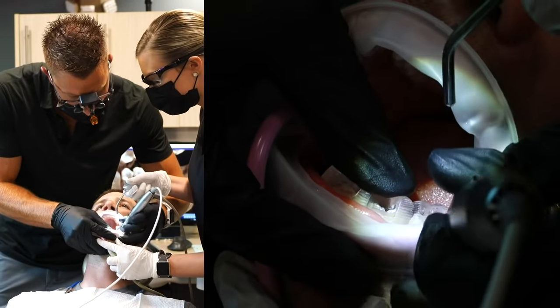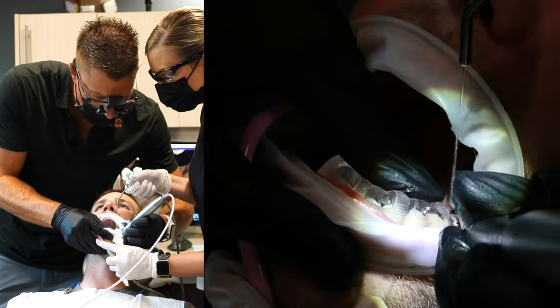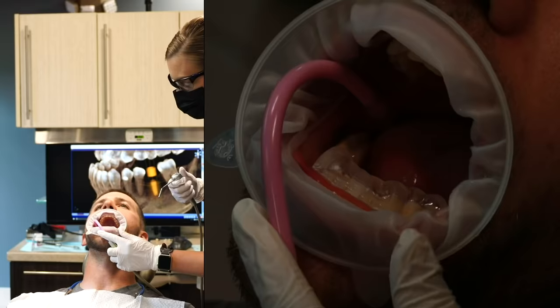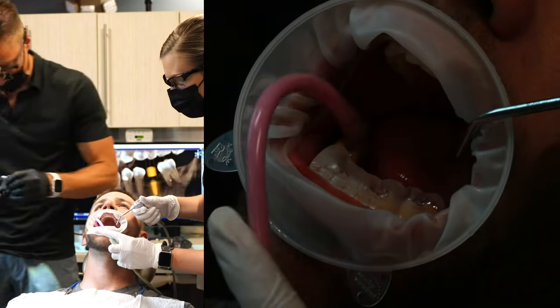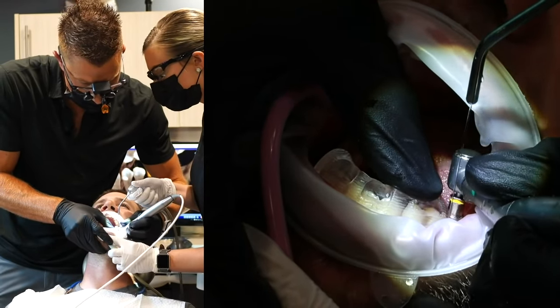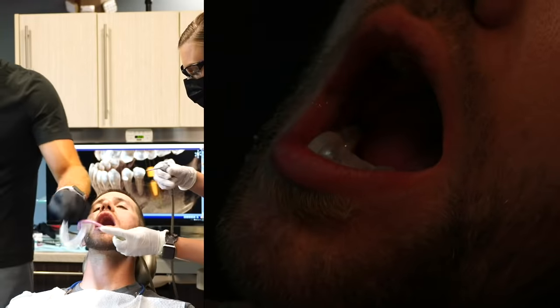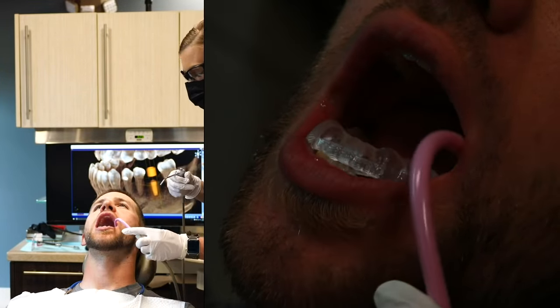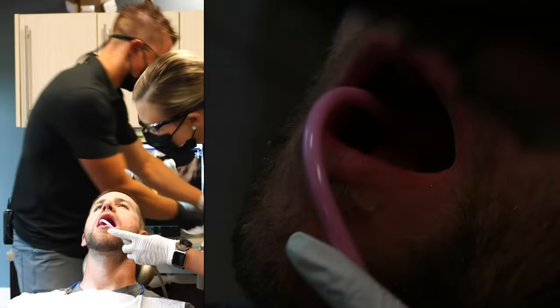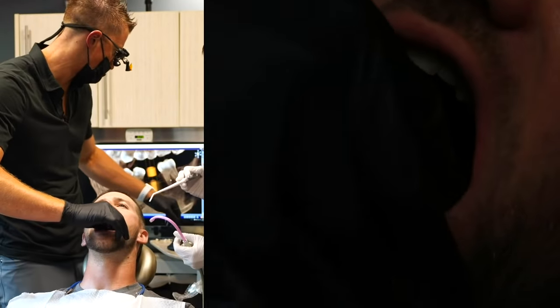Nice job. Almost done with that hole. So all I'm doing is making the hole just a little bit bigger for us to place that implant. We're almost done with that. Good job. Oop, lost that there, didn't we? So, I'm going to suction him out there. Doing really good there. We're just going to go ahead and place our implant.